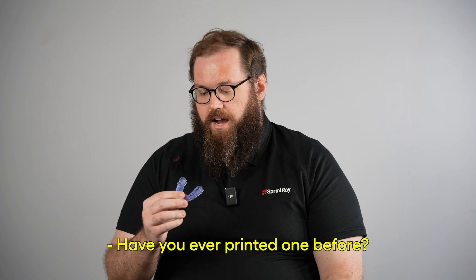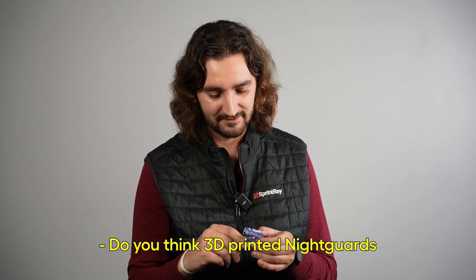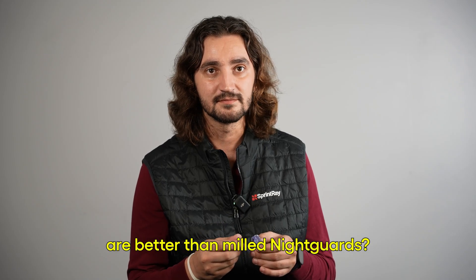Have you ever printed one before? Printed one for my father. Quite a few. How was that processed? Easy setup, easy printing, easy washing, easy curing.